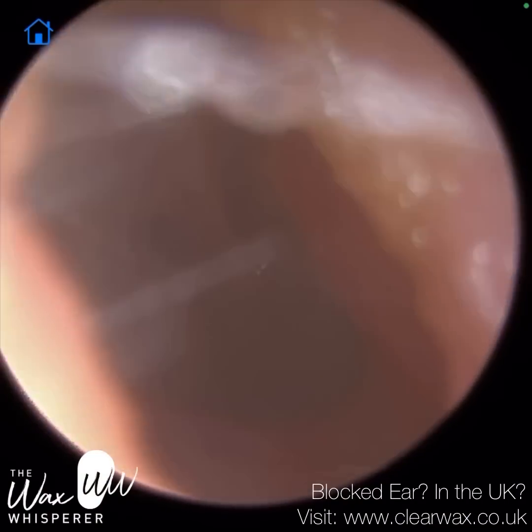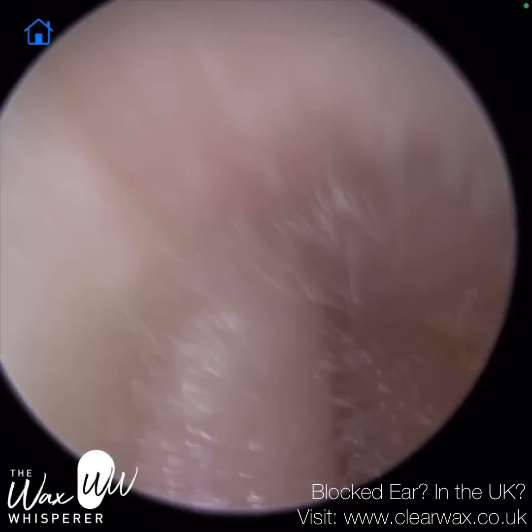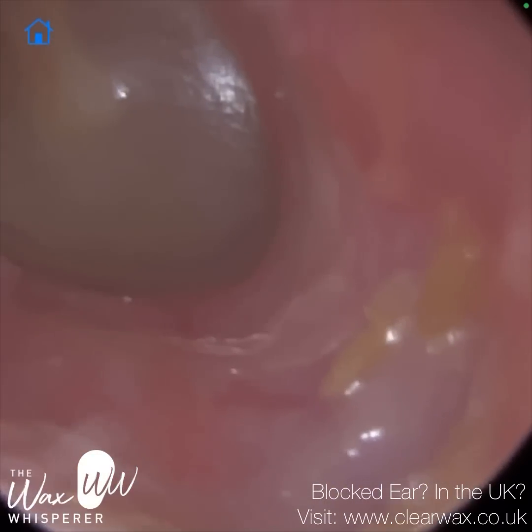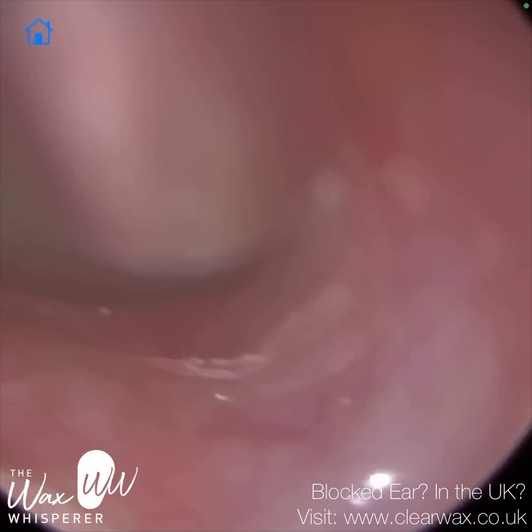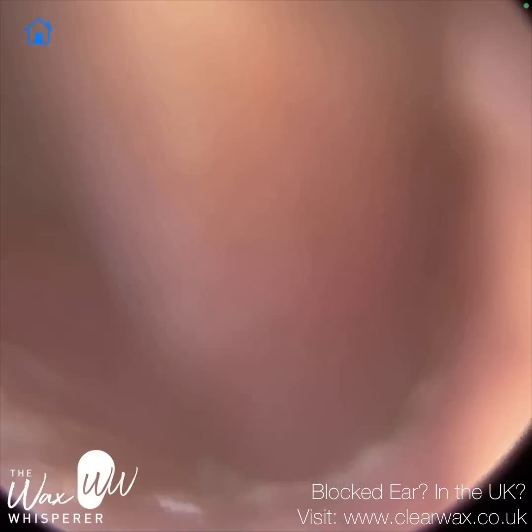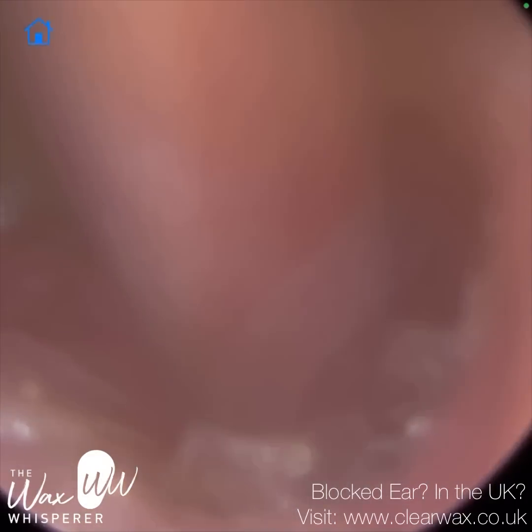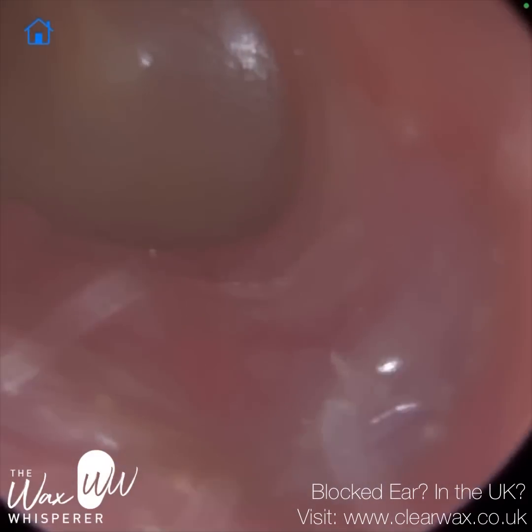I'm just zooming in there — you can see we can see the top part of the hammer bone. Probably over-zoomed in there. Just zoom back out. On the right-hand side of the ear canal, the patient's got this protrusion of the bony part of the ear. There's a bit of crusted dead skin just at the bottom of the ear canal, and I think this is where the zoom would be good with the endoscope — it really can look at some of this fine detail. We're working against the canal wall; it's just slightly buried because there are a few hairs there. Just peeling that away.